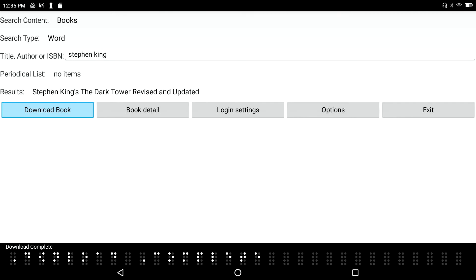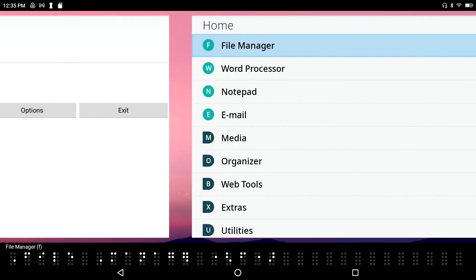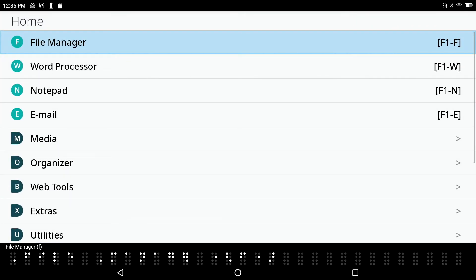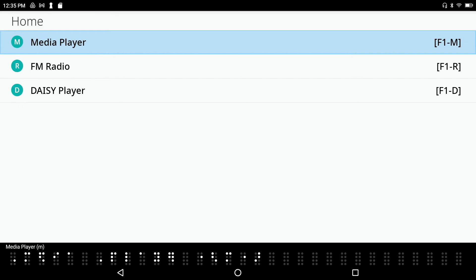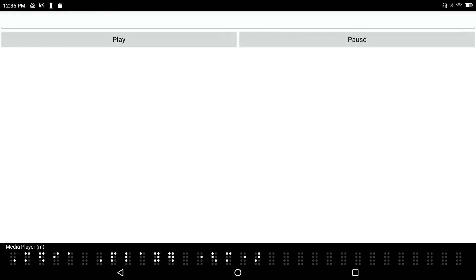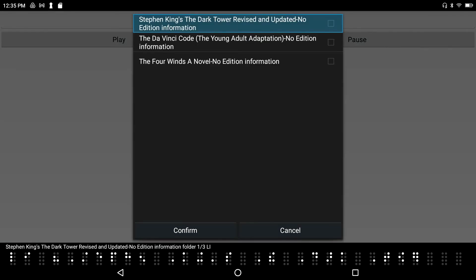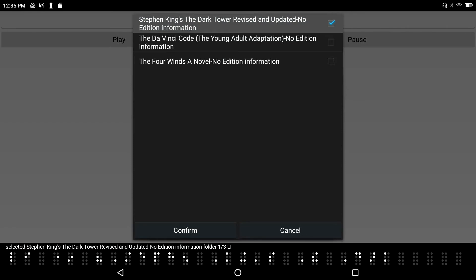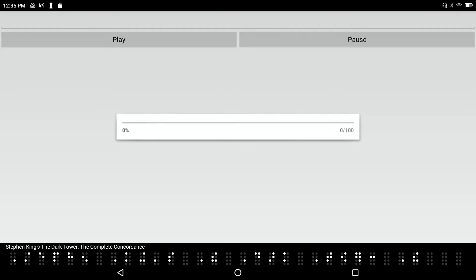I'm going to go back to my main menu. The Daisy book reader is under the multimedia menu, so I'll press M from the main menu, and letter D for the Daisy book reader. Stephen King's The Dark Tower Revised and Updated. I've got a few books in here and the first one happens to be the one I just downloaded. To select this book, I press Space on it.